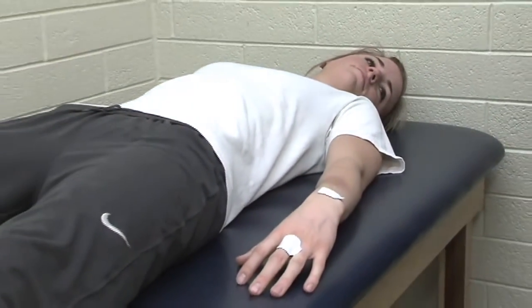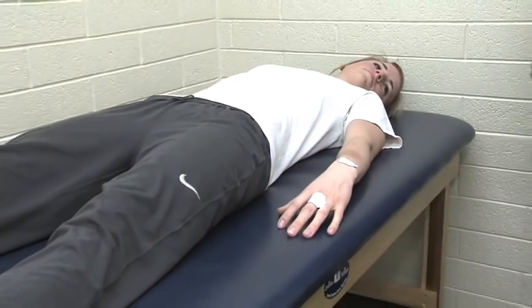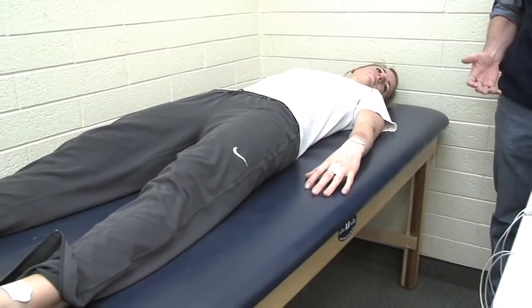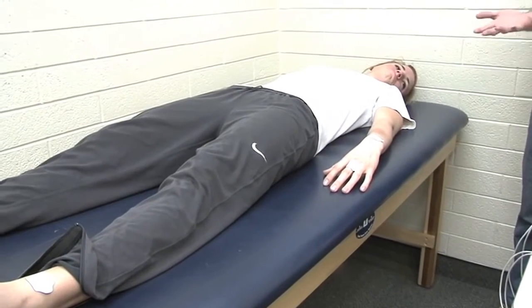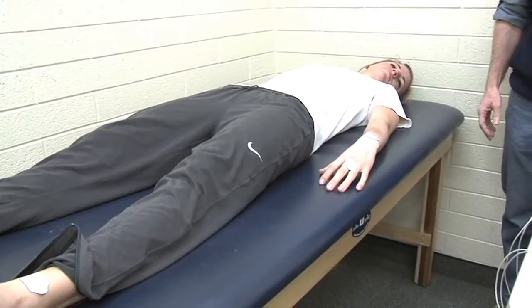She's in a good position right now. We also want to make sure that she's not wearing any metal because metal is a good conductor. And so our setup is all ready.